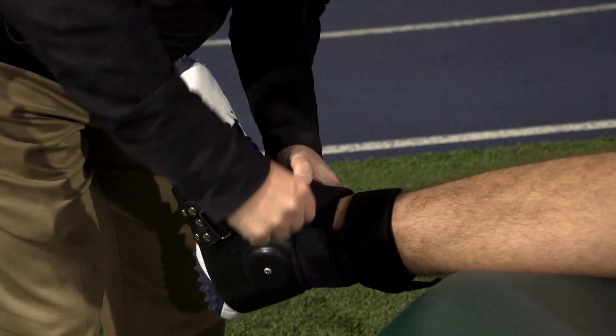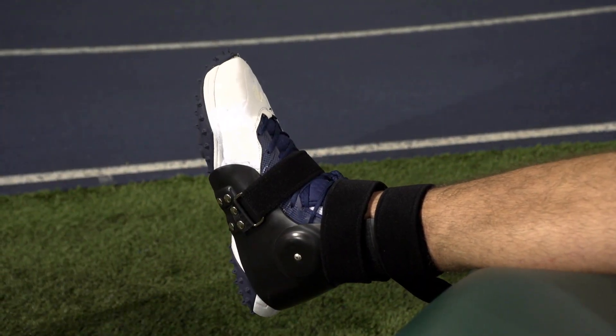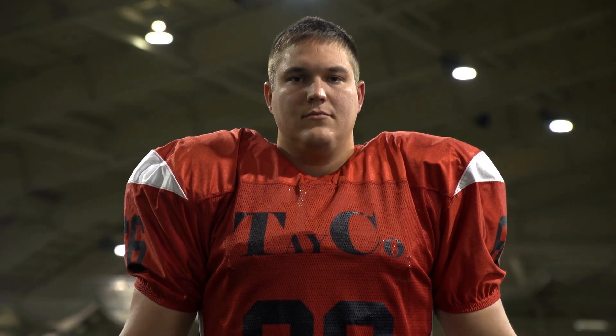Step 5: Secure the mid-foot strap again, tightening as needed for comfort and fit.